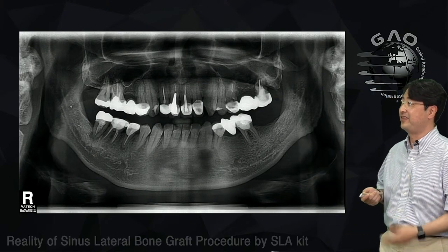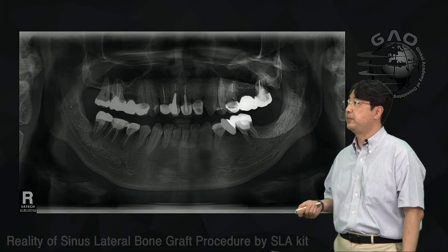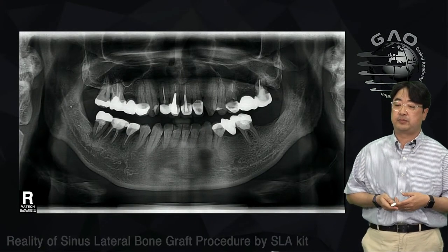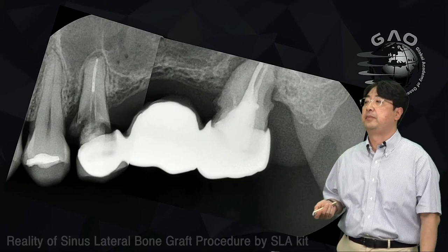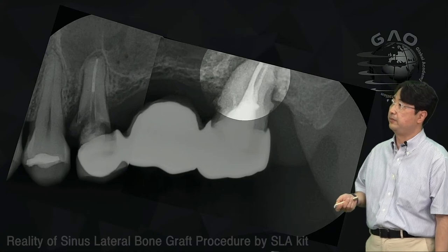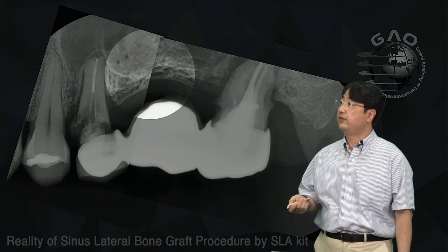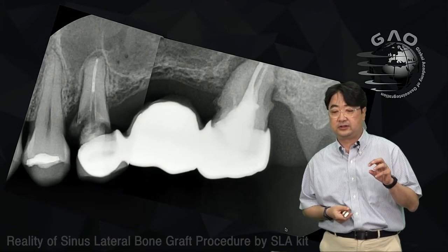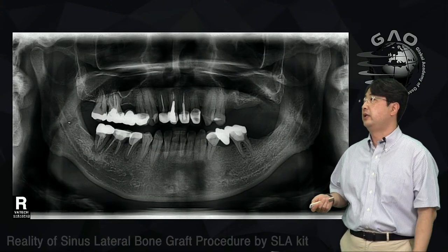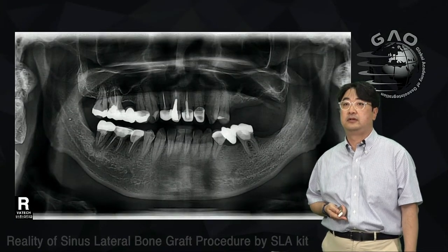Well, this is my last case today, right? So time goes very fast, and it's already been more than 30 minutes. Okay, so here, this patient needed to extract number 25 and number 27 for a 3-unit fixed partial denture, because the patient had a fracture on number 25, and also you can see the periapical lesion on number 27. And you see here, this part has very thin cortical bone left, as it is pneumatized, right? Well, I removed the teeth, number 25 and number 27, right?